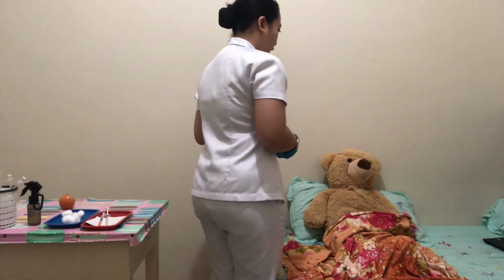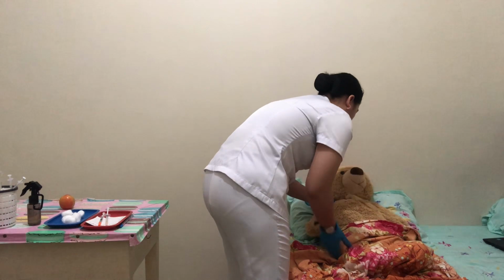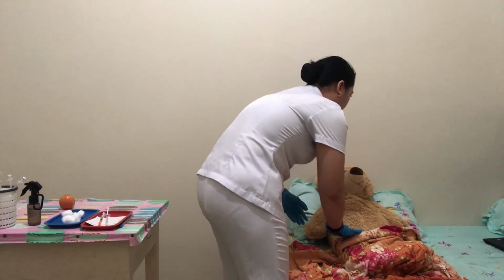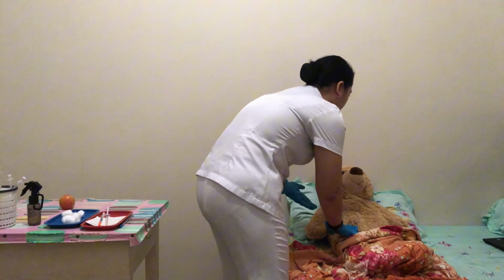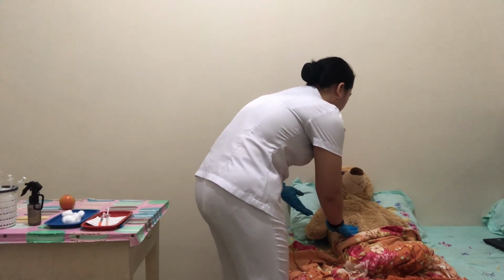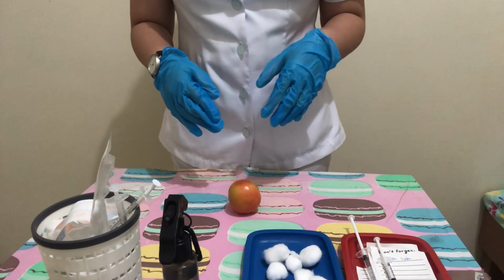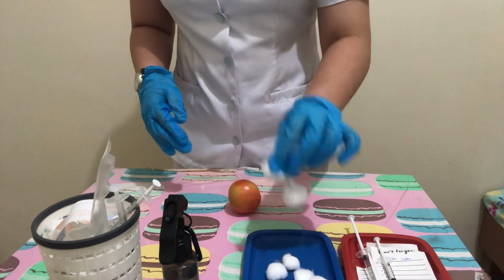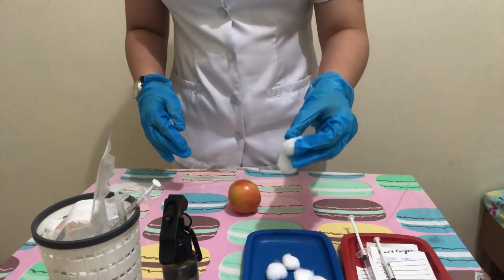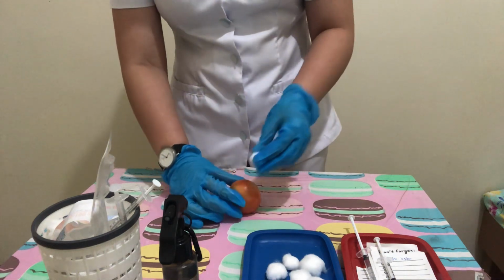So, ma'am, do you feel any pain in your abdomen? And can you please relax your abdomen for me? Alright. Now clean the site using an antiseptic swab in a circular motion, starting at the center of the skin, circling outward.